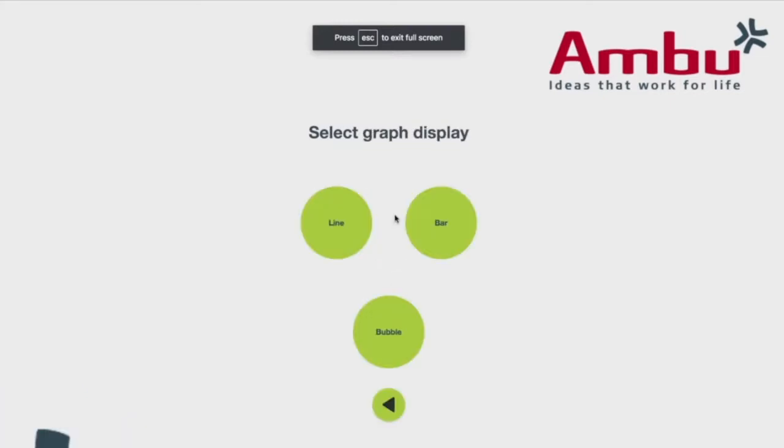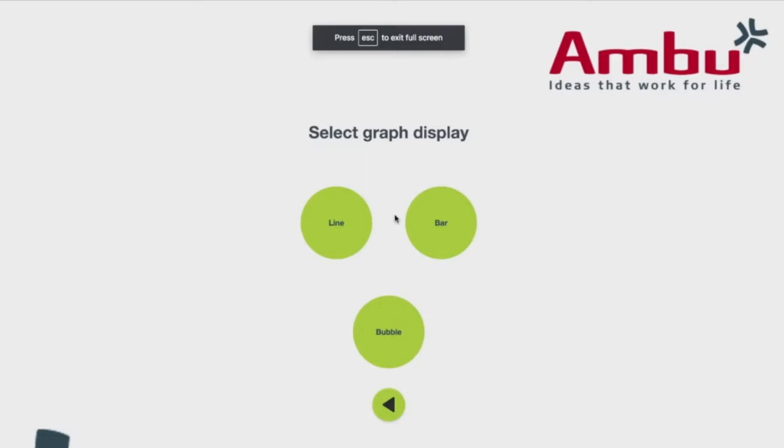Now it's going to ask you to pick how you want your graphics to display, either as a line, a bar, or a bubble. And those three selections are in your AmbuMan W, AmbuMan D-Fib, and AmbuMan Airway Wireless. When you get to AmbuMan Advanced, you'll have a fourth button option, and that will be a monitor view, which will be a simulated defibrillator screen.